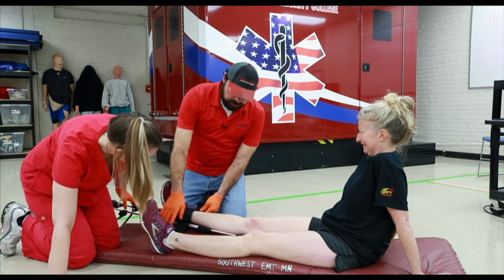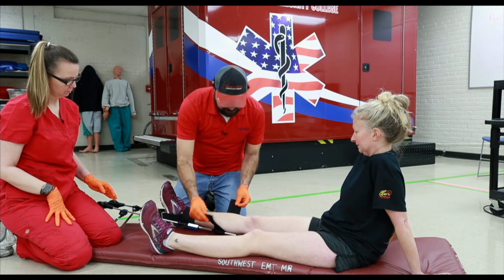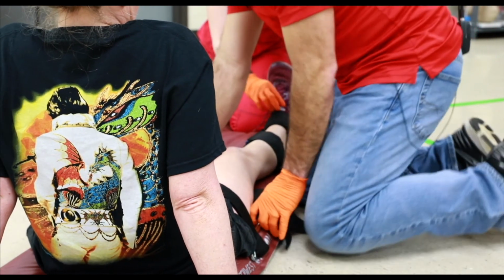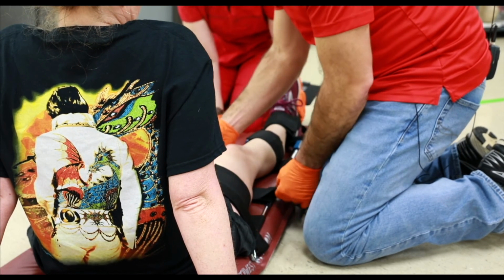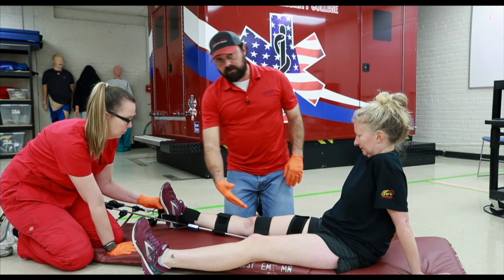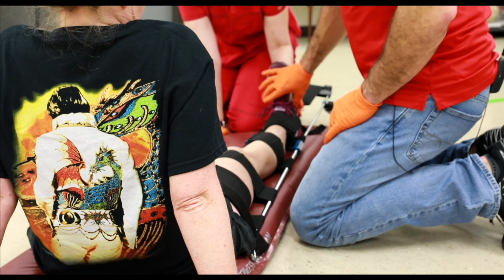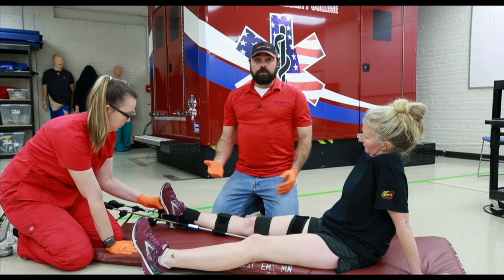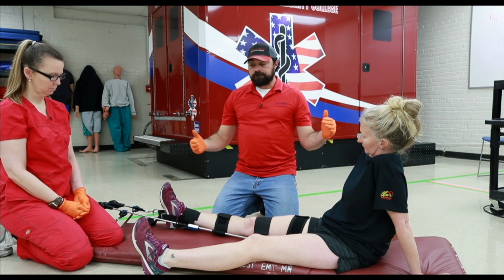Now you can check pulse motor sensory, but that's not necessarily going to be the thing that's going to change where you're going to place the splint, because you're going to have to keep the splint where it is. Remember again, you don't want to place the straps over the fracture site, and you do not want to strap over the knee, so above or below the knee, not over the joint. Once you have this in place, it's completely secured. You can go back, you can assess your pulse motor sensory, make sure your patient's comfortable and not feeling the pain, the spasms. Now you want to try to move your patient over to a spine board, and then place them on a stretcher for transport. That's it.